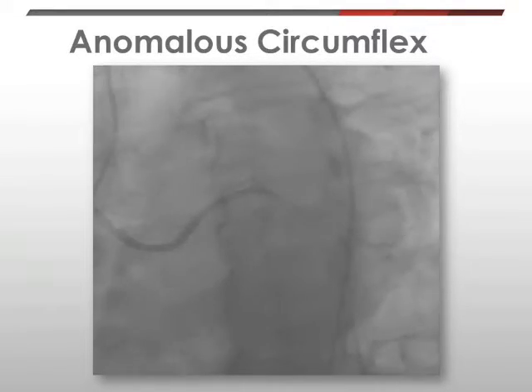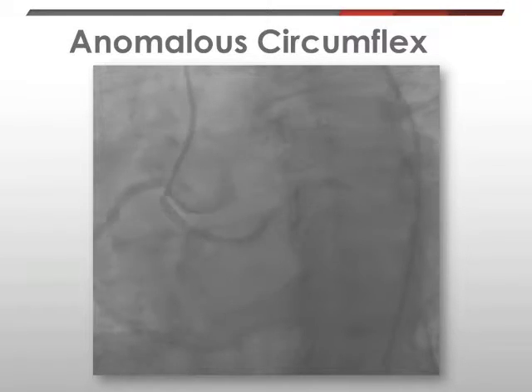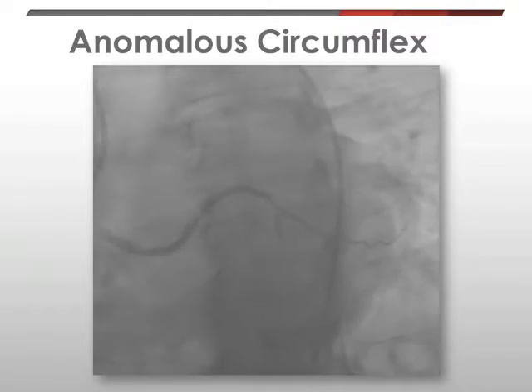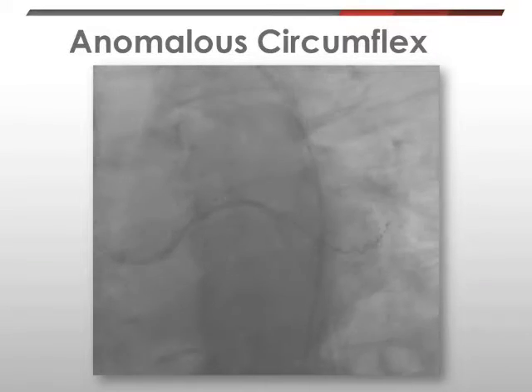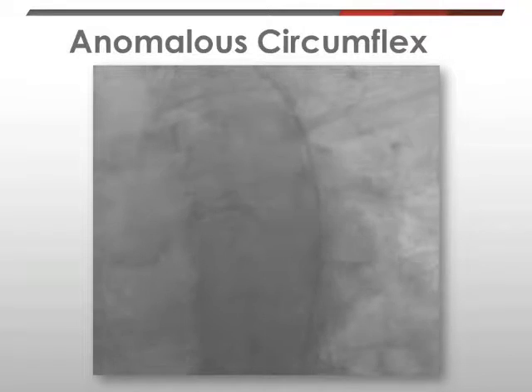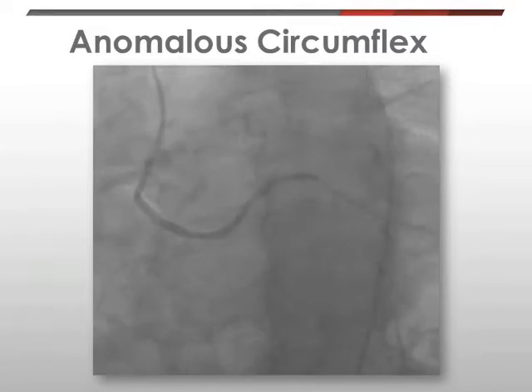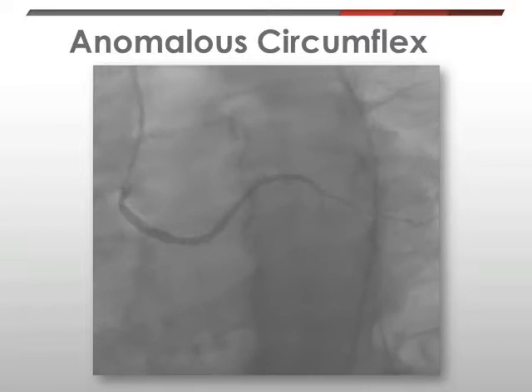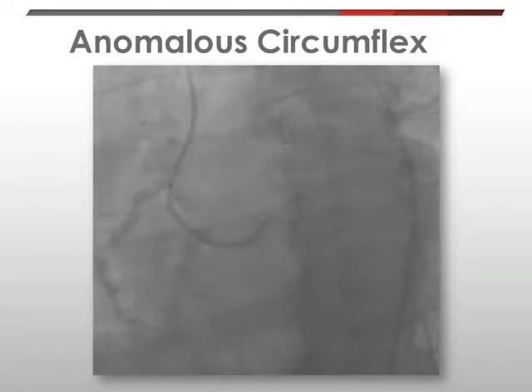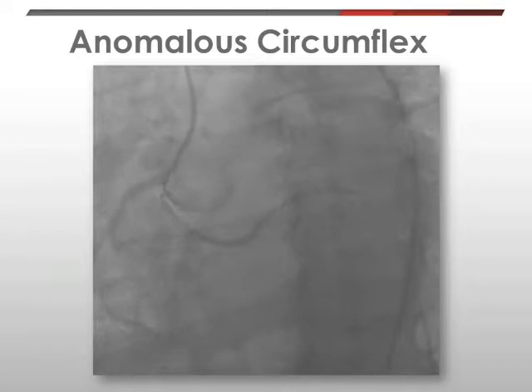I did not appreciate anomalous left circumflex arising from the right coronary cusp with a standard injection via JR4 diagnostic catheter, and often these vessels have an inferior takeoff. Therefore I elected to perform injection with a multipurpose catheter, successfully now visualizing the anomalous takeoff of the circumflex from the right coronary cusp, as you see here in this view.